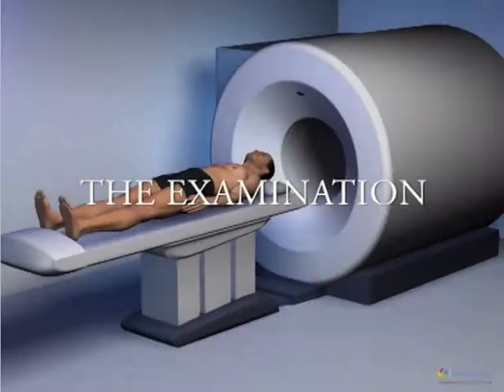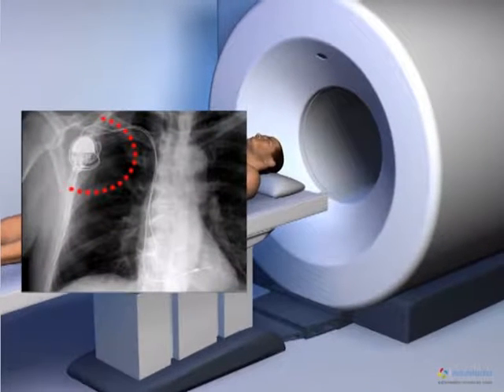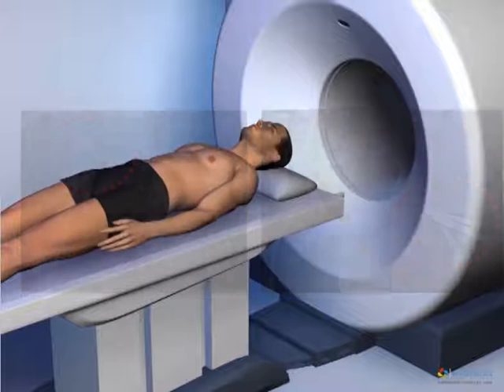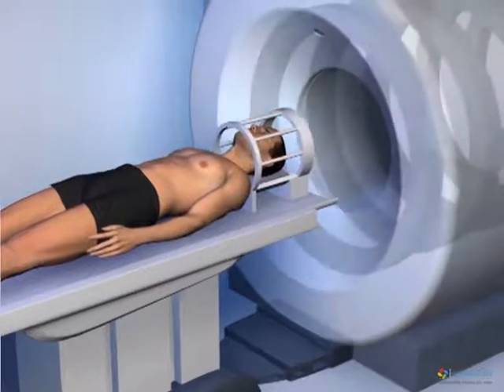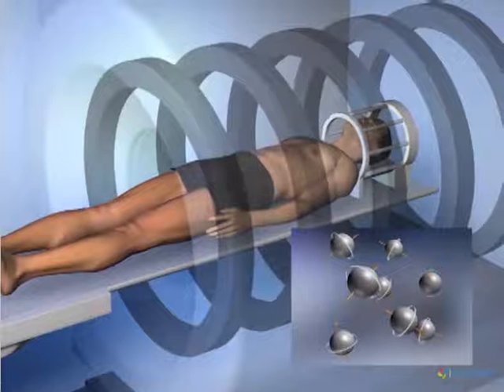The patient must first of all remove all metal objects. If his or her body contains a cardiac pacemaker or metallic pins, the examination cannot be carried out. The patient lies down on the examination table and an antenna is placed around the region to be examined. The table is moved completely inside the tunnel.